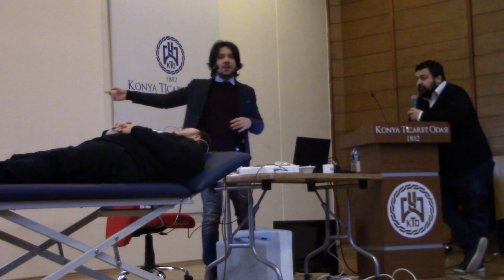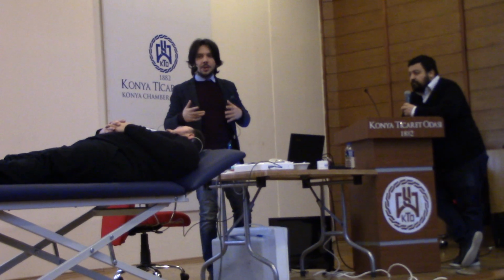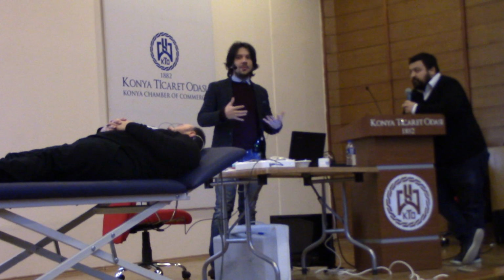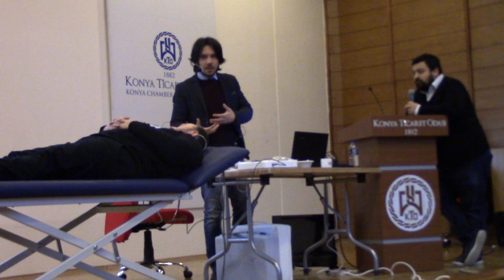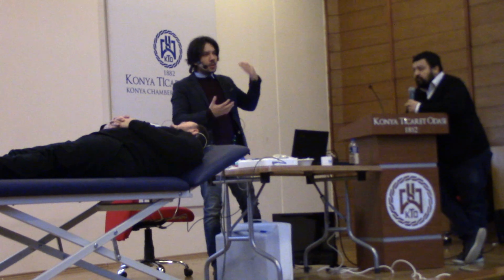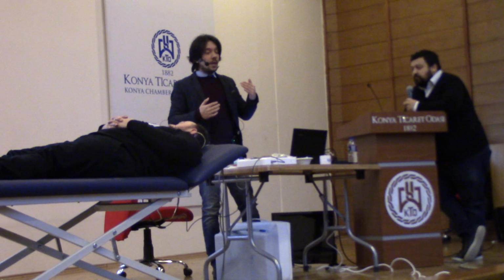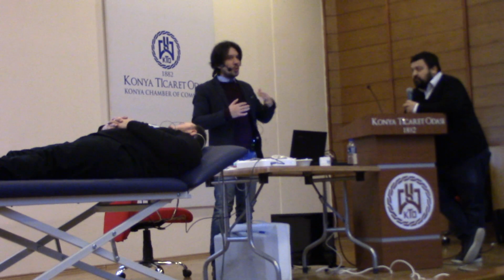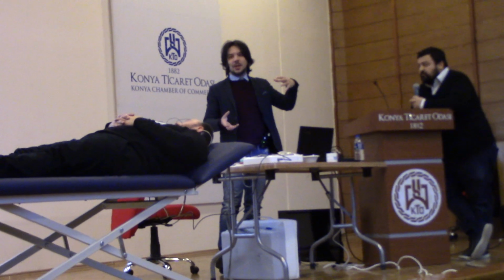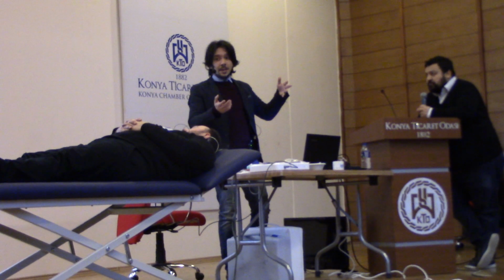Sometimes you don't know if it's a fifth peak or not. Of course, signal to noise ratio, residual noise, and repeatability are parameters that can help you to understand if there's a fifth peak or not. But sometimes they're not enough. In the chirp stimulus, you can see it till threshold, and don't expect so much big fifth peak with respect to the click in higher intensity.